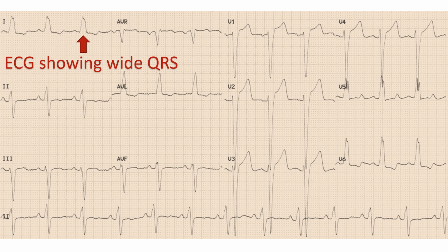A left bundle branch block pattern on ECG with wide QRS complex is the often cited criteria. Left bundle branch block is the electrical block in the part of the conduction system which takes signals to the left ventricle.